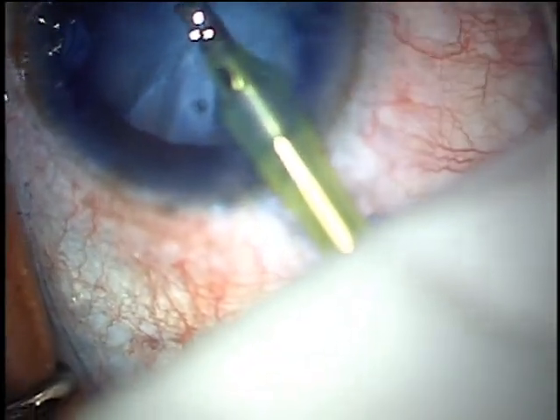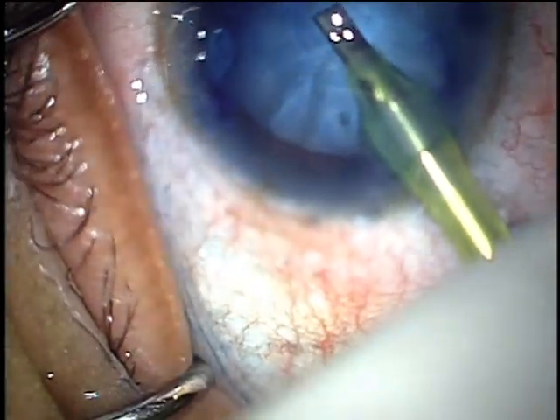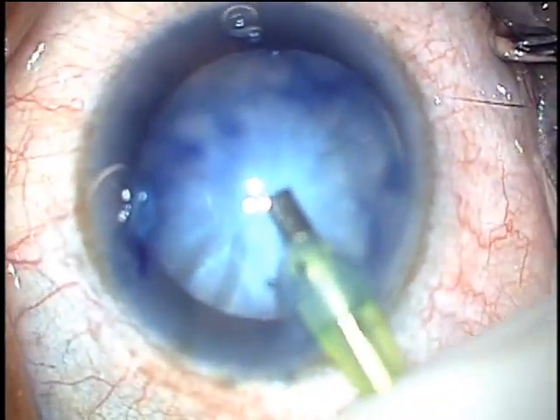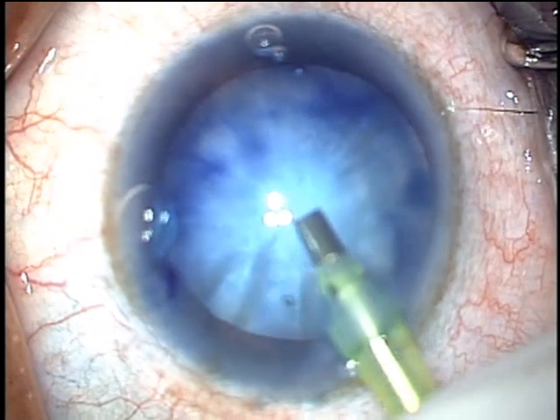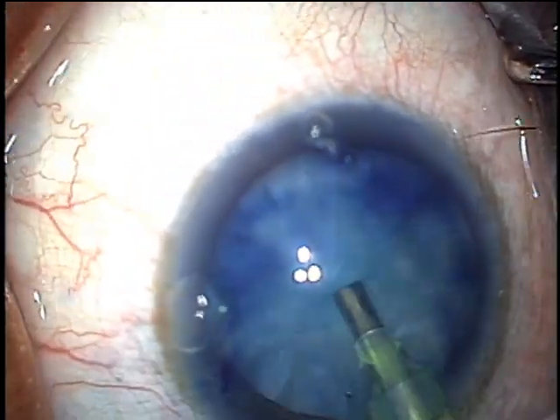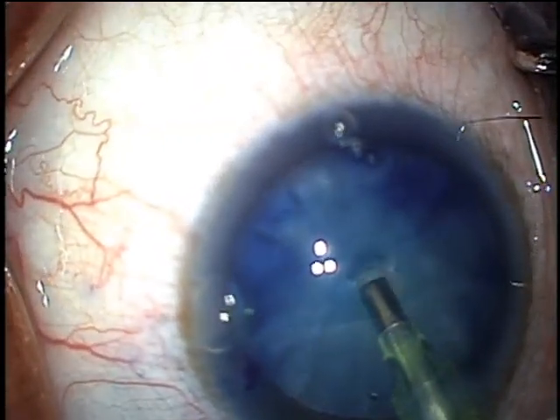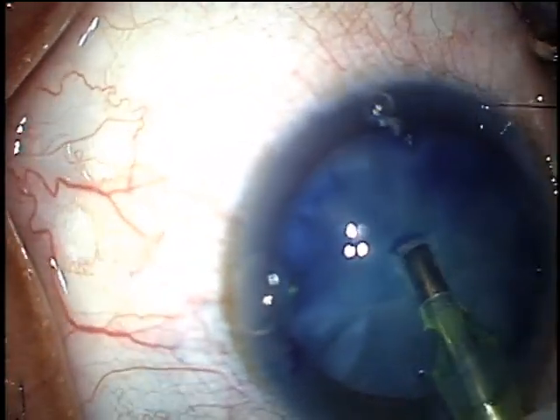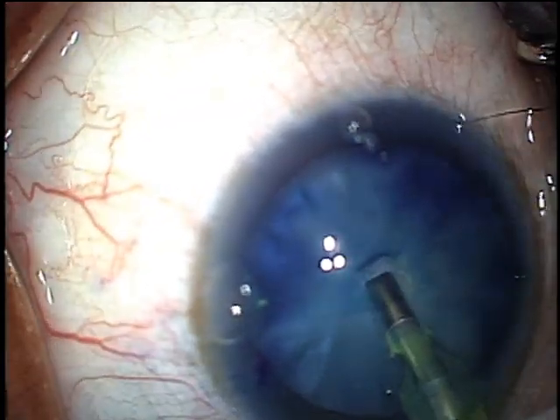Press gently down on the capsule until you get a dimple, and then use short bursts of FACO emulsification in position 3 to get through the capsule. Once you're through, go back to irrigation aspiration in position 2 and remove any liquefied cortex, decompressing the lens.